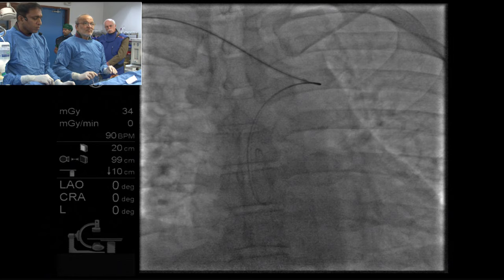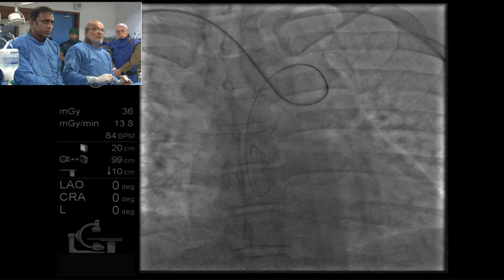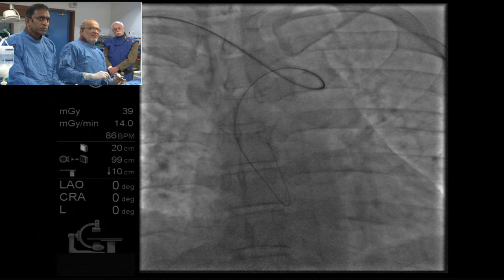It won't go. Yeah. No. Usually there is no role for an extra stiff wire, but in such cases, I think yes. Yes, I am slowly, inch by inch, traversing. So Rajni, I personally feel that if we have extra backup, jackhammering. Entering.